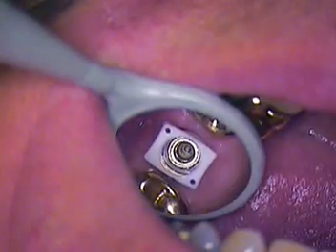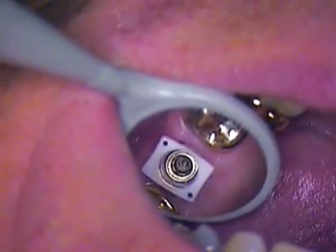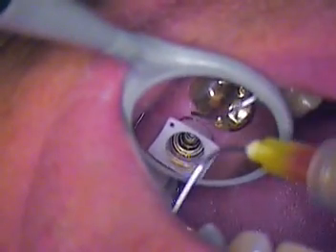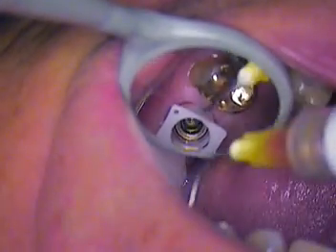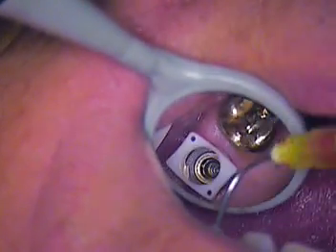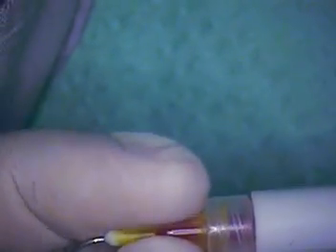Looks good. So now we're going to vacuum again with the small vacuum. I believe this is a 20 gauge suction tip for those who want to pick it up. I believe the company is called Vista. And Ultradent's another good company. It's a Lock, so you can plug it into, yeah, this connector actually is the oh, sorry, John. This is the connector for the Lock. Alright, and that gets in place.